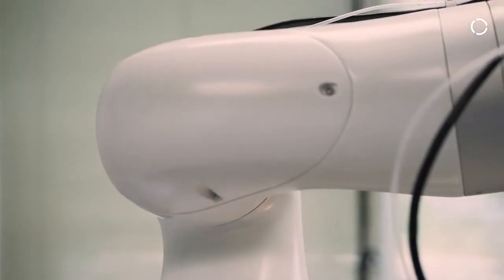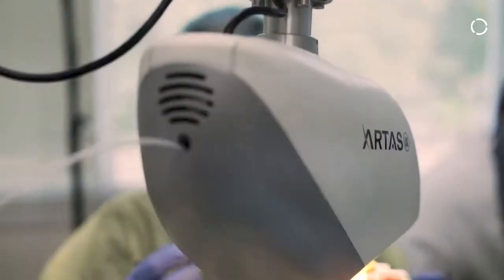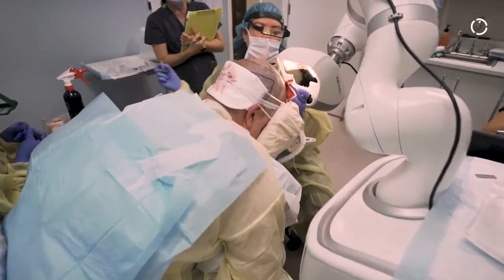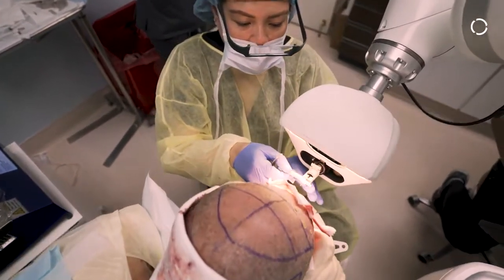The fact that you can monitor every single joint and know exactly how much force and how much torque that joint is producing, that's a big advantage when it comes to safety, especially when you're working around the surgical staff and the patient, and you're trying to create that symbiosis. That helps a lot.